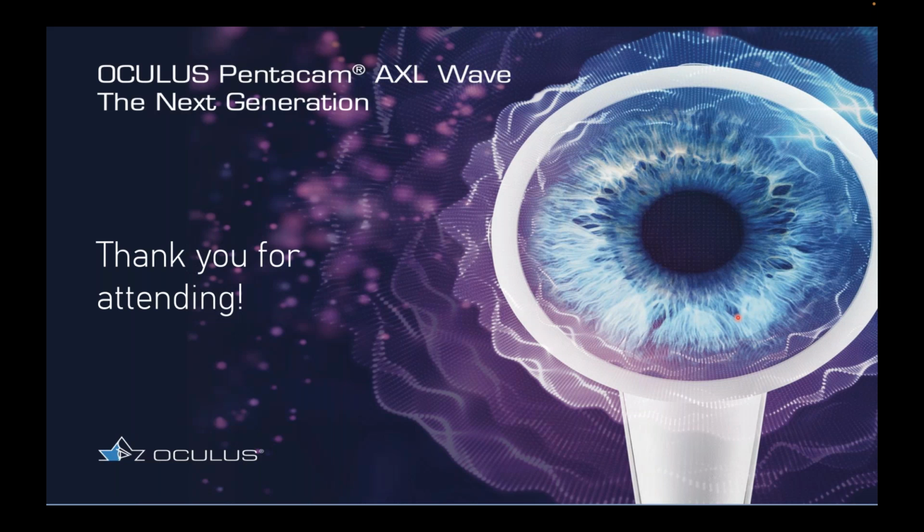Yeah, I've got a few I've been working on. I think it's been one of those things where in the last year it's kind of been a new thought to move that route. If we create a larger diameter lens, of course, we can create more alignment out in the periphery. Then we can have a little bit of a larger optic zone and control that clearance and keep out the bubbles. And I think you can make it happen. And I do see the potential for more of that again as we can create these nearly full corneal lenses with a controlled amount of apical clearance.